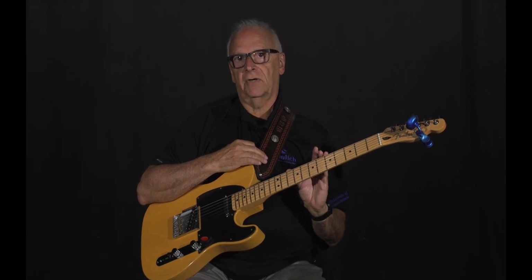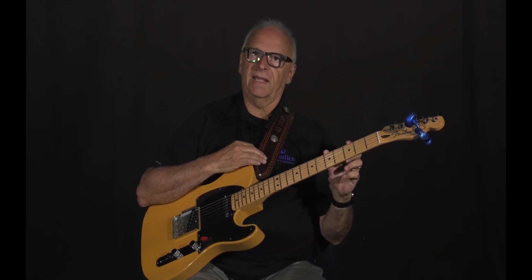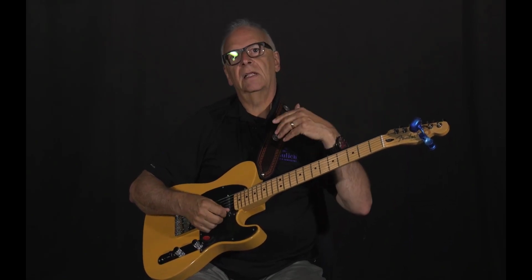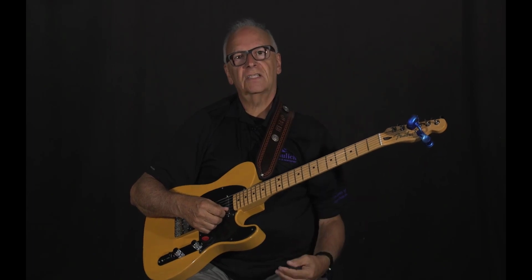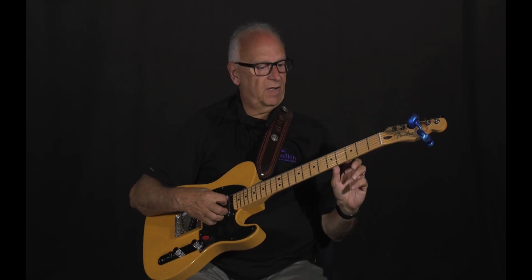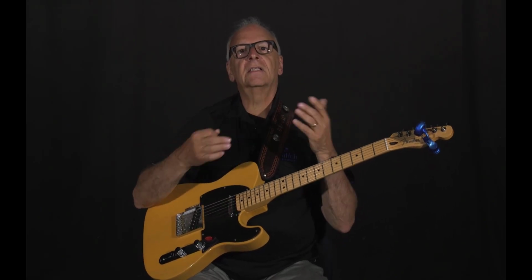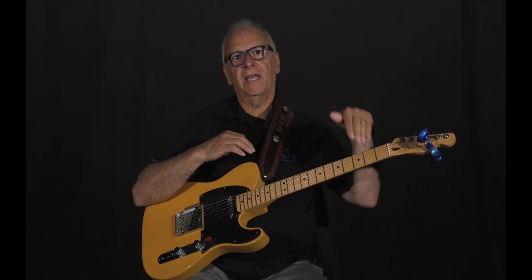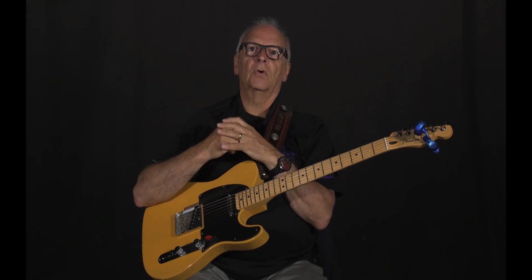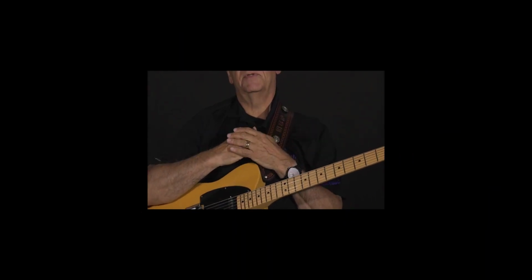What affects the frequency of the strings from the basic physics equations is the linear density of the string, the mass per unit length of a string. So obviously, a big string has a low frequency. A thin string is less weighty. It'll vibrate much faster for the same plucking, and you can hear that here. So we have a gradient from the large string to the thin string, an increase in frequency. And this one-dimensional gradient up and down is also used in magnetic resonance imaging, as we shall see later. So we develop gradients of frequency, and this is a good parallel with what I just described.